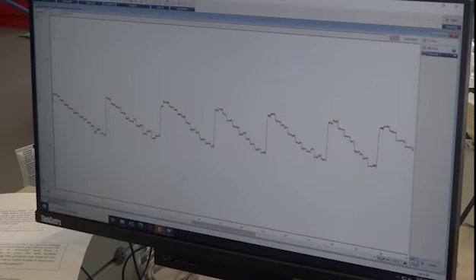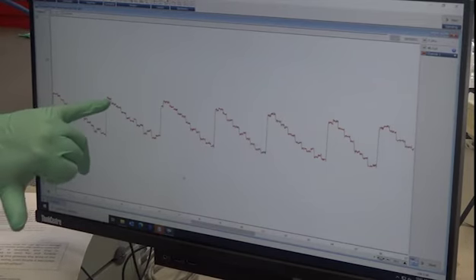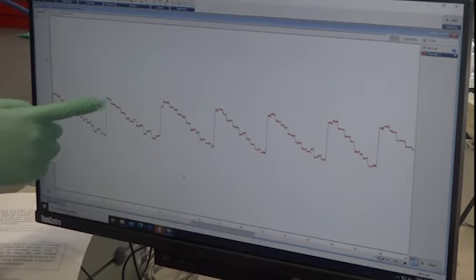So in our case, we're going to be starting very, very positive in our signal. So here would be the start of a line, the top of the staircase. Each time the signal goes flat, we're looking at a particular word or a cluster of words. We'll then have a small negative deflection in the signal as we're shifting our gaze to the right.